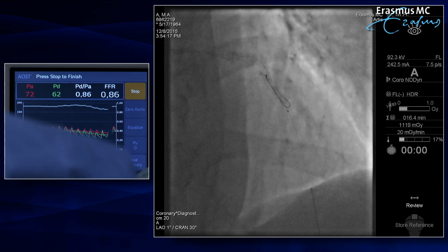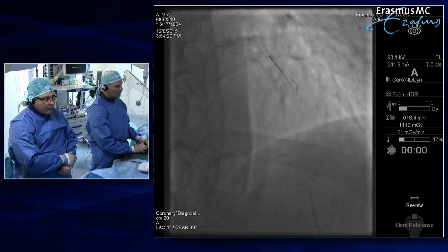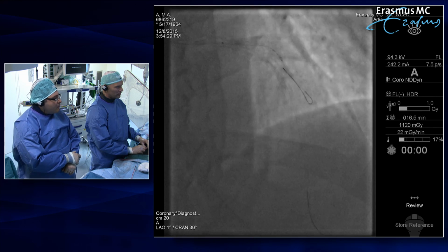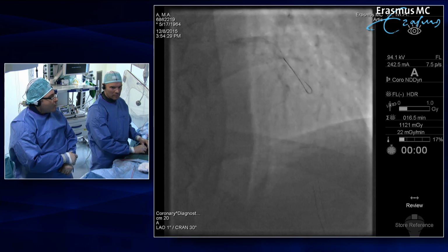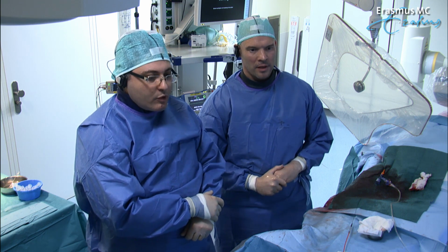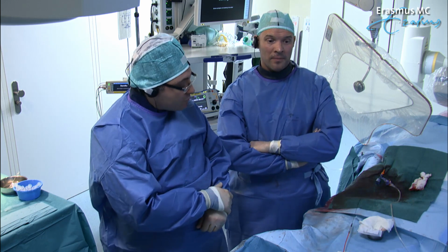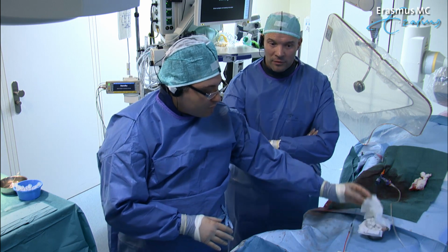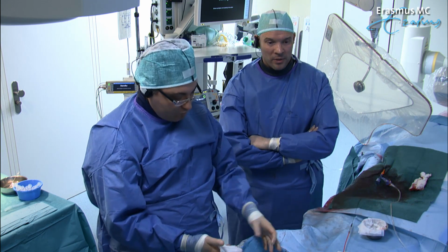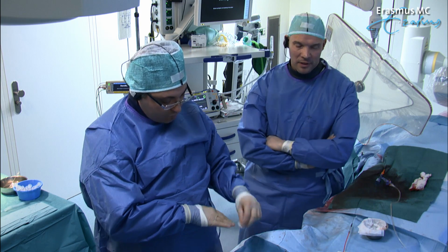So, Nicolas, I think we do not have a lot of time remaining for the live transmission. Maybe we could wrap up our ideas for this case and what we have learned. First of all, we tackled a quite challenging distal left main stem disease, and we assessed it properly up front, so we were confident that this was significant disease.